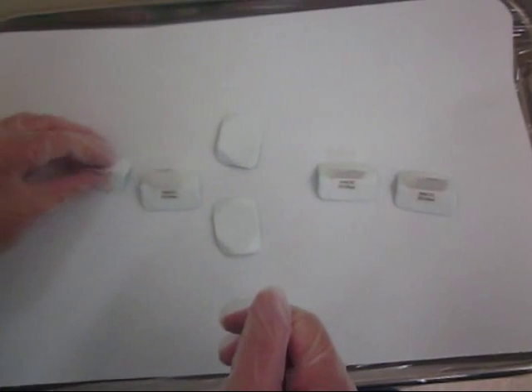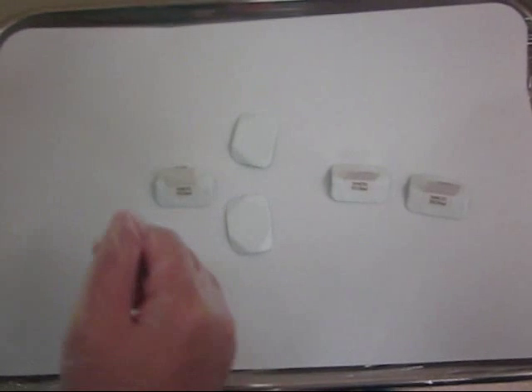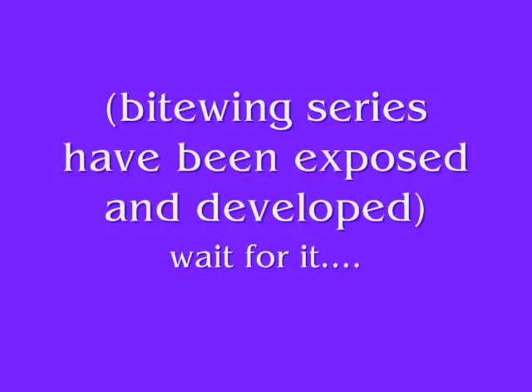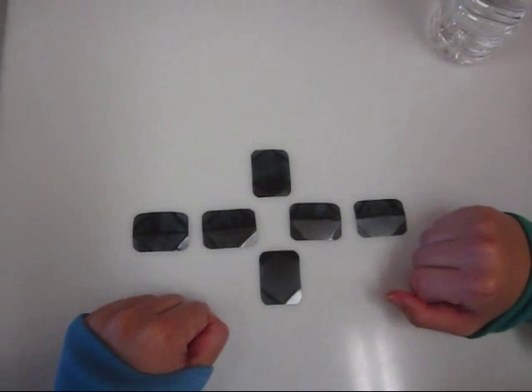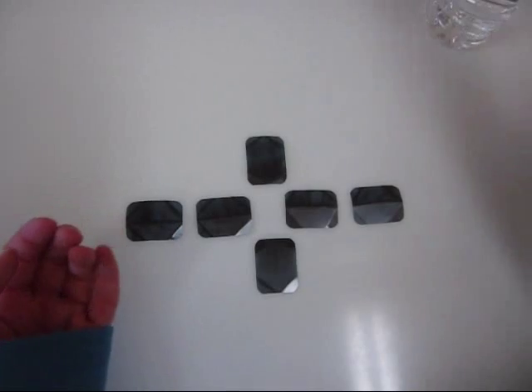Good. Okay, everything's good. Let's go ahead and get started. Mr. Dexter, you ready? All right, Mr. Rad, my x-rays are ready. Okay, let's see how they turn out.